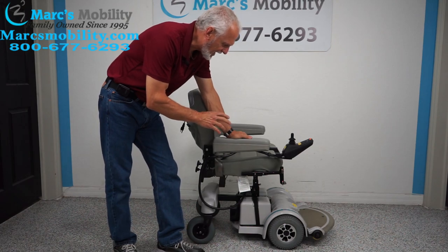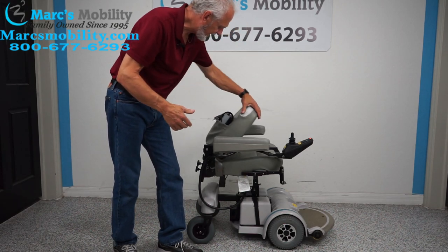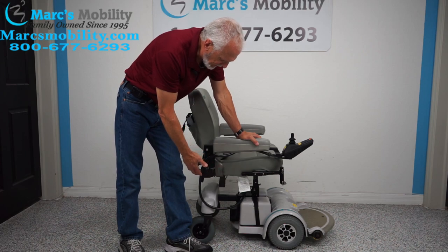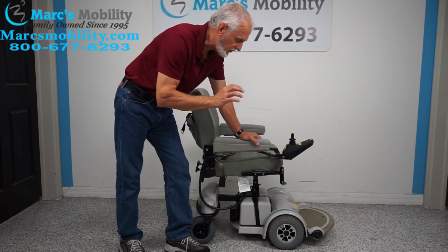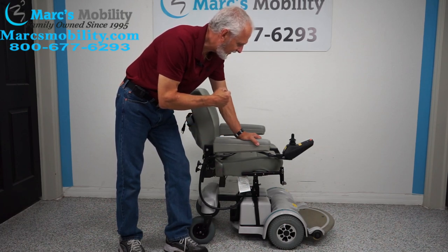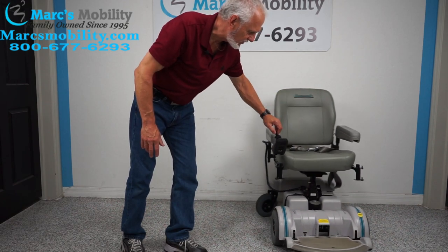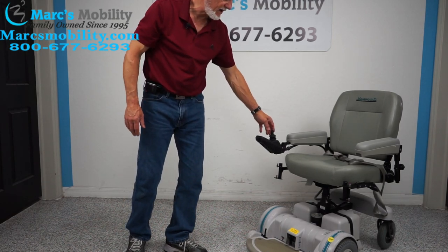This is a Hoveraround MPV-5 with a 5-inch seat lift. The seat is 20 by 18 deep, it's a fold-down seat, the arms flip up, the joystick's on the right — if you're left-handed we can switch it to the left side. It has regular tires, two batteries, and a range of about 15 miles in perfect conditions — if you're going outside in the grass uphill you're not going to get 15 miles. We're keeping the seat and the scrape on the fender as-is — it's just not worth fixing because the chair is in excellent condition and ready to go.